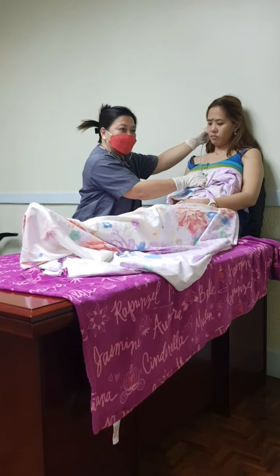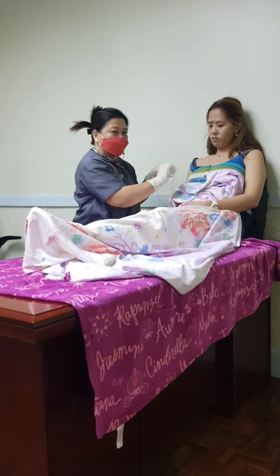Mark the tube with a marker pen or tape.